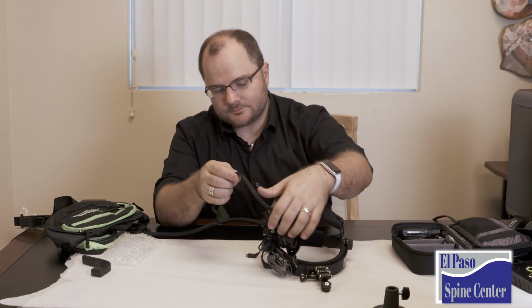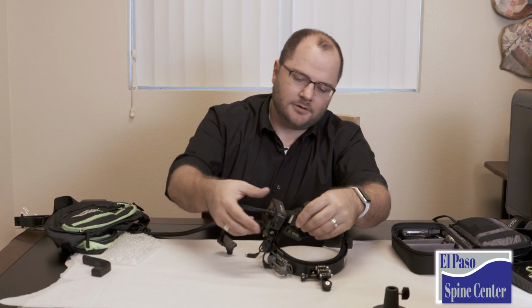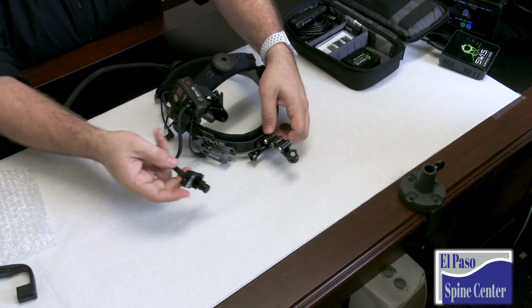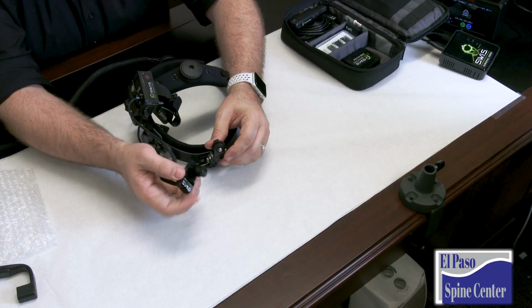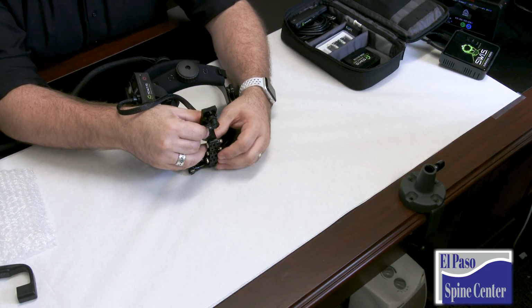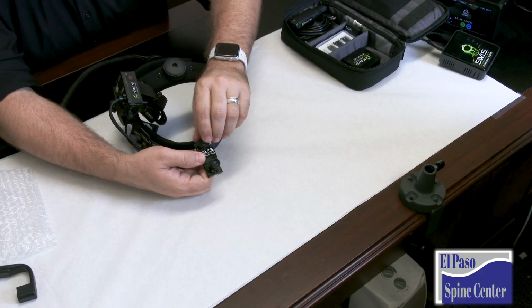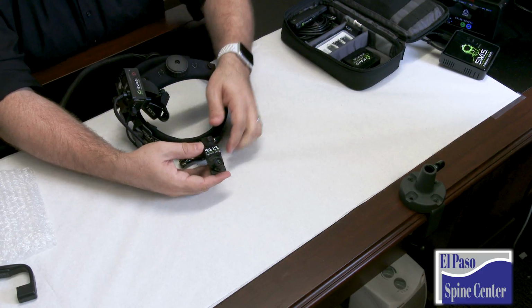I am then going to take the power supply for the GoPro, and that just plugs into the back of the GoPro. The lens system, that's going to attach to the front of the headgear. Now, the first time I did it like this, and that's a little awkward. I probably recommend putting it where it is going to be up. And you just screw it into the mounting point on the front of the headgear.